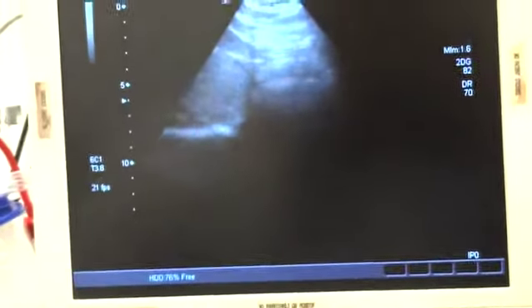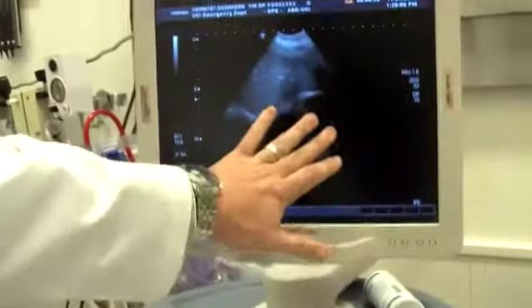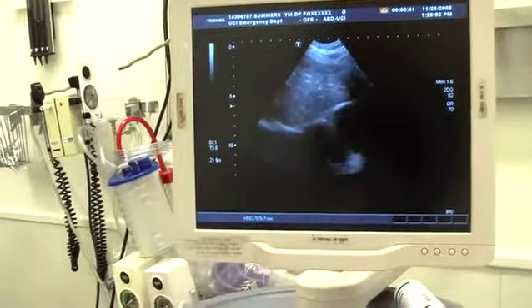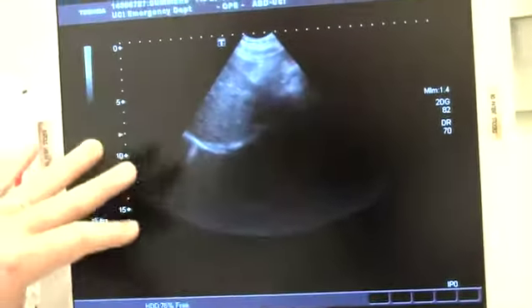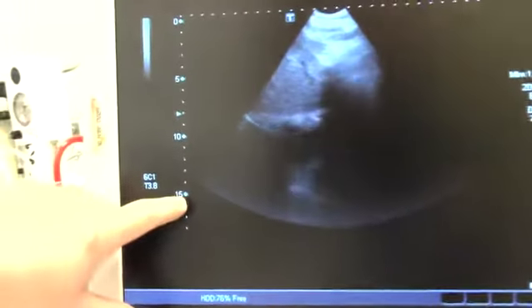So I can see part of my heart's off the screen, so I need to change my depth here. I'm making the sound penetrate deeper, or I'm paying more attention to echoes that are coming from deeper structures. So now I'm imaging structures that are as far as 18 centimeters deep. Here's your depth indicator on the left-hand corner of the screen.